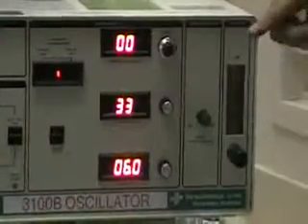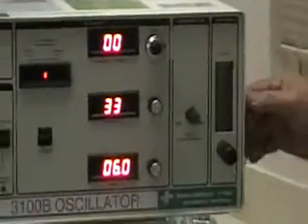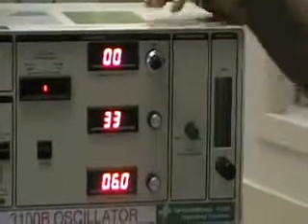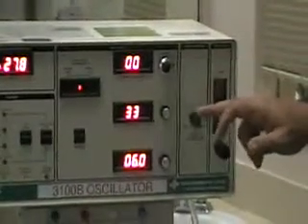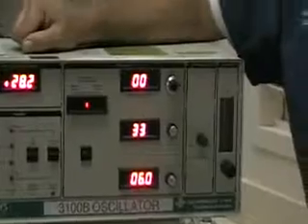You'll want to set your bias flow at 40 to begin with. I know that in the calibration procedure and the on-patient procedure, we had it up to 30. It's going to require more than that from the majority of your patients that you're going to be dealing with. So you want to set this up to about 40 liters per minute, and that'll give you a little bit of leeway on your mean pressure adjust. So you will set this at 40. Initially, we're going to set our inspiratory time at 33%.